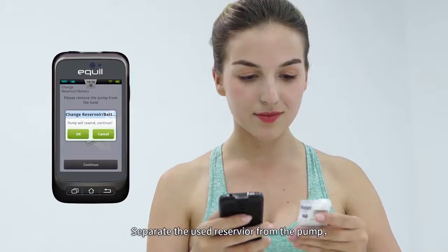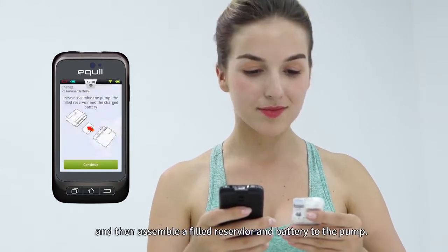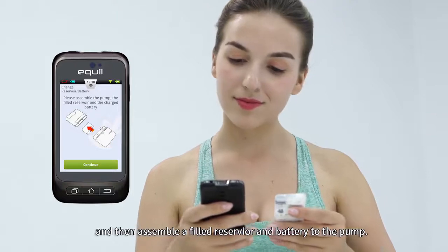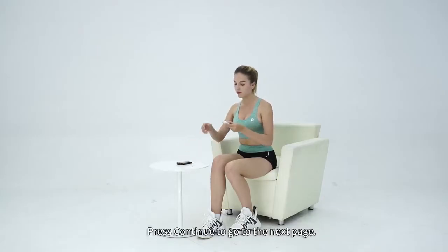Separate the used reservoir from the pump. Dispose of the old reservoir and then assemble a filled reservoir and battery to the pump. Press Continue to go to the next page.